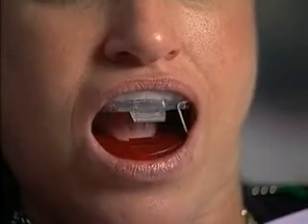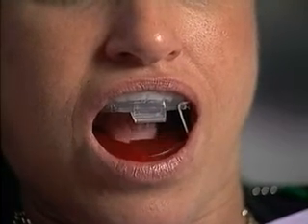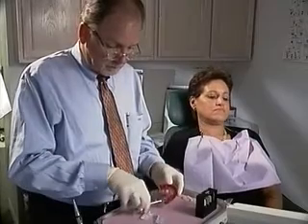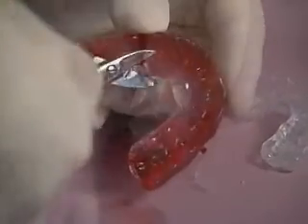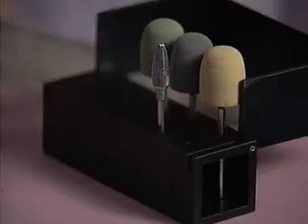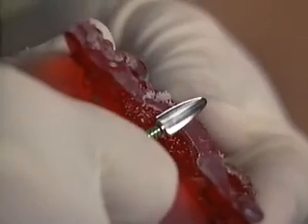If the upper and lower components remain in place while the patient opens and closes, it's time to move on to the finishing process. The finishing process ensures maximum comfort and fit. Using a pair of curved trimming scissors, cut away the excess material protruding over the edges of the trays. Complete the trimming process using the carbide burr from the NORAD finishing kit in a slow-speed handpiece.